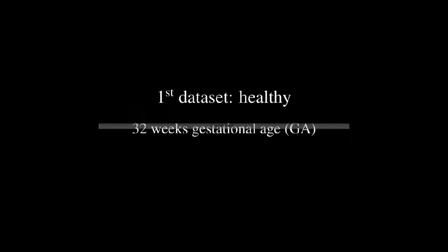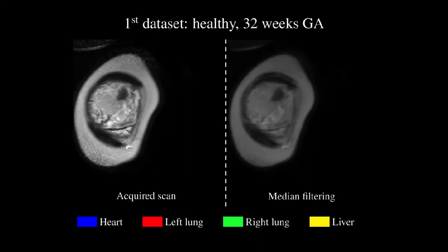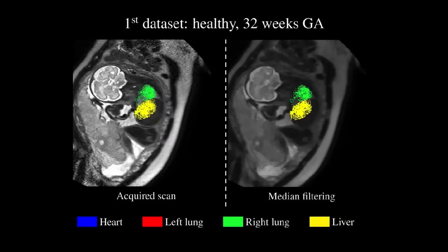We now present some localization results. The acquired images are shown on the left, and a denoised version can be seen on the right.